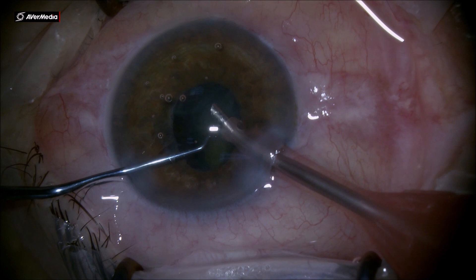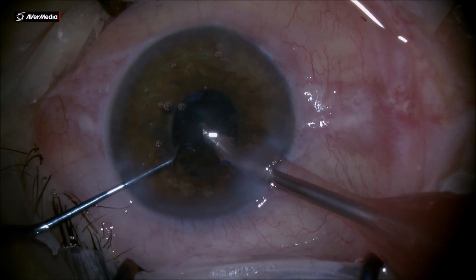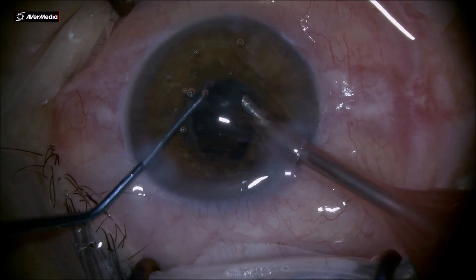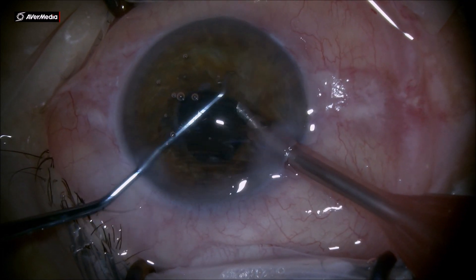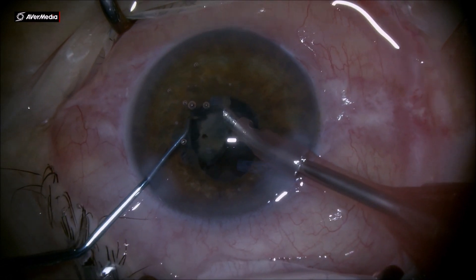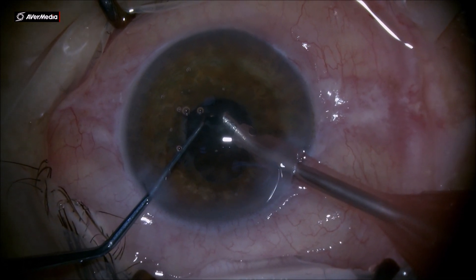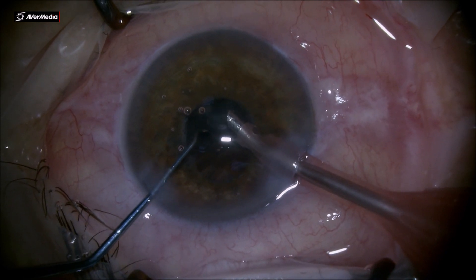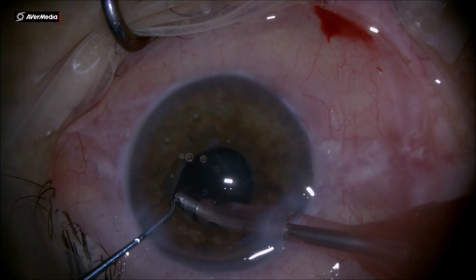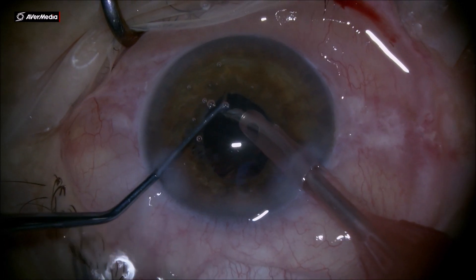It's very important in these glaucoma patients to have a clean bag at the end of surgery. It's very important to check underneath the floppy iris to see if you don't have any cortex or epinucleus hidden between the iris stroma and the bag, or inside the bag, because any cortex left there can cause inflammation — and in these closed-angle glaucoma patients, it can be very damaging to the endothelium.